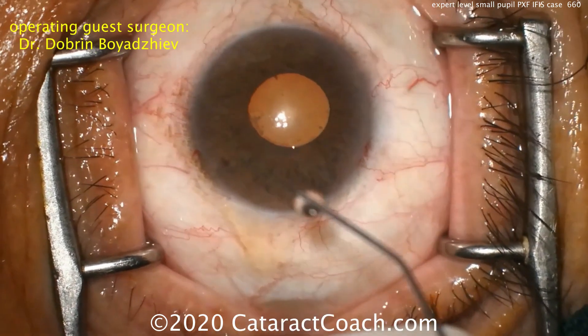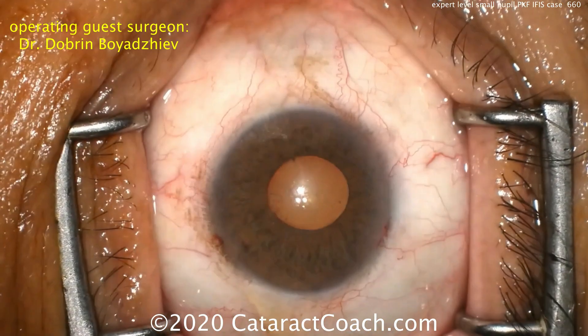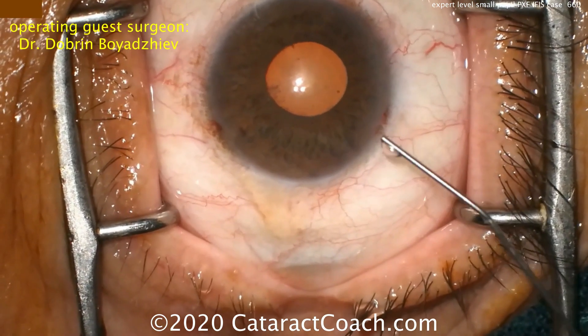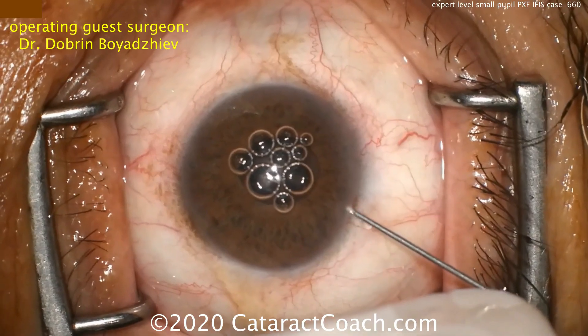This is a case where we're going to use multiple different things to expand the pupil. The first thing you're going to do is a pharmacologic agent. Some anesthetics like lidocaine can help expand the pupil, or other agents such as phenylephrine or epinephrine — all of these are able to help expand the pupil.